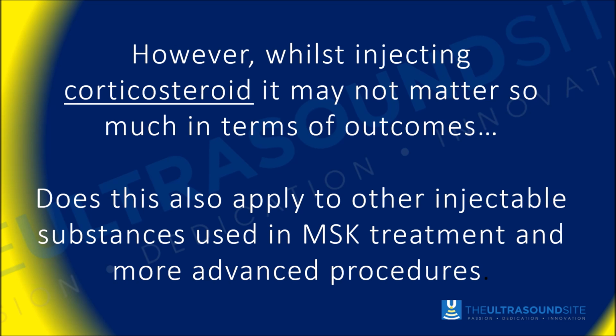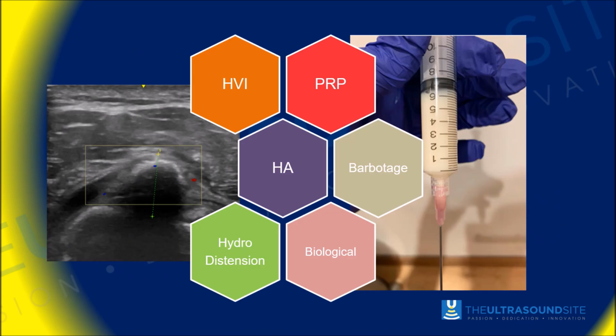To name but a few, we can think about high volume injections, autobiological treatments such as PRP, hyaluronic acid, and also some of the more technical procedures. So we might be thinking about barbotage, hydrodistension, high volume stripping procedures. So we need to think really broadly, particularly around where some of these treatments are increasingly being developed.